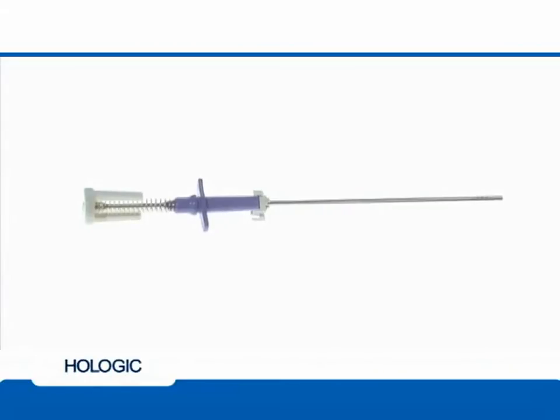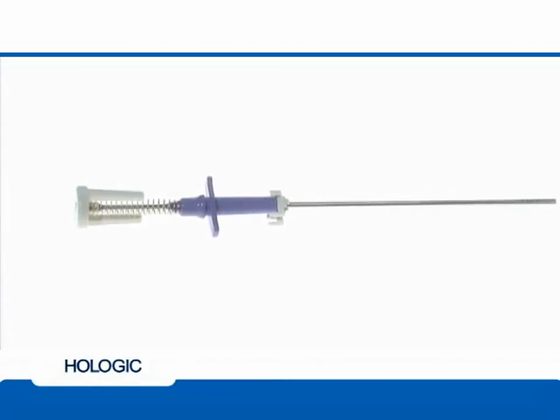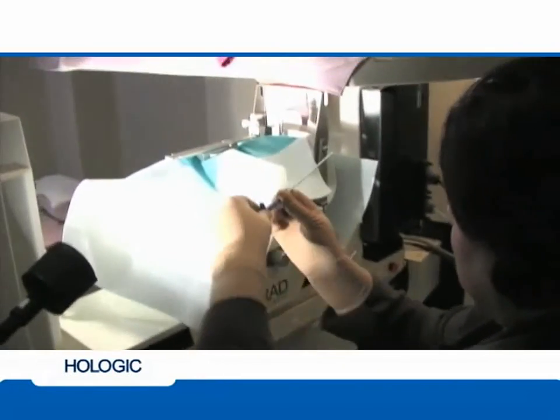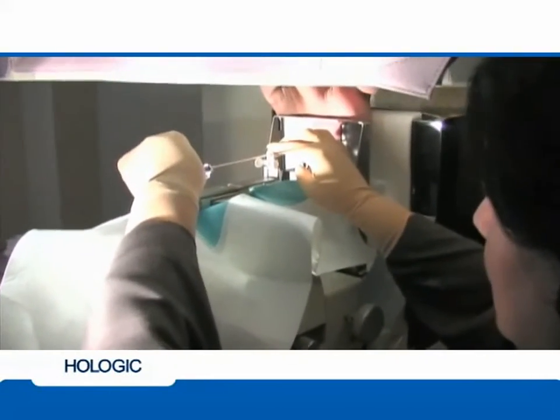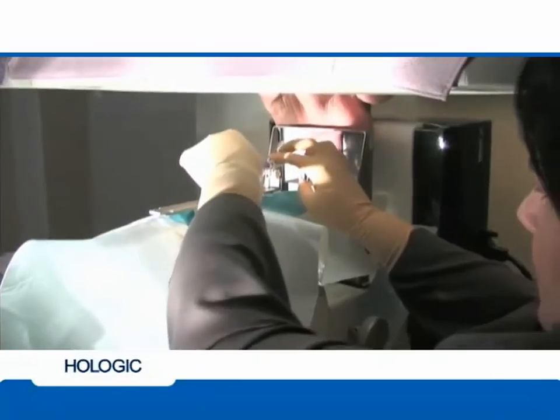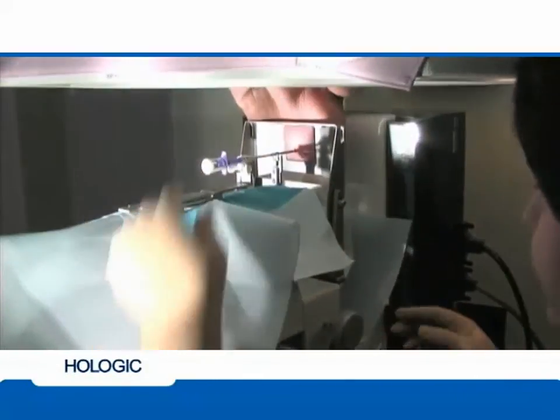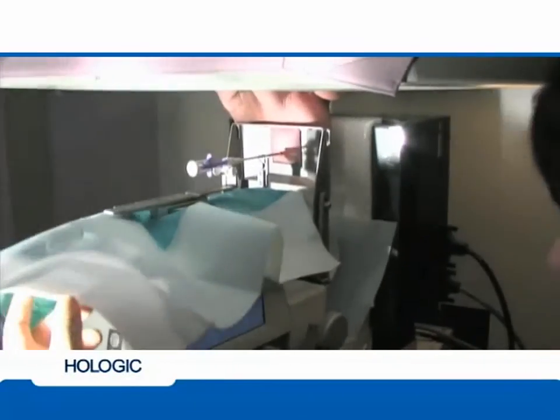For this demonstration, we will be using the Secure Mark for Eviva biopsy site marker. Insert the Secure Mark for Eviva deployment device into the introducer. The deployment device will lock into the introducer. Deploy the marker by fully depressing the plunger until it locks.